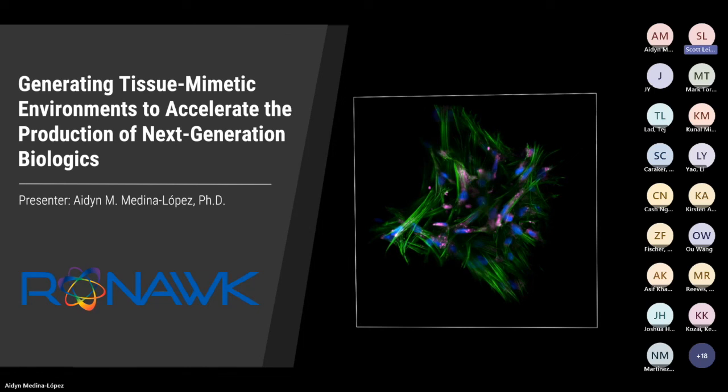Great. How thick are the bioblocks, and is the oxygen tension the same throughout the depth of the bioblocks? Oh, you missed our first couple of slides. Yes, so our bioblock is 1 centimeter cube. And yes, the oxygen is retained throughout the entirety of the bioblock. We did a study with O2M where they tested the oxygen diffusion throughout the block, and it's pretty consistent.